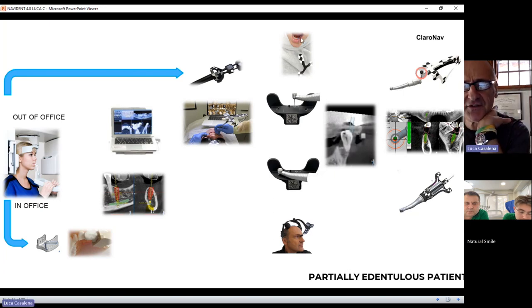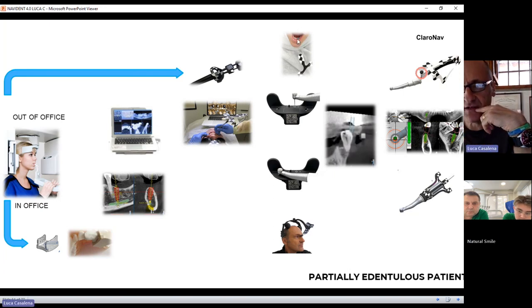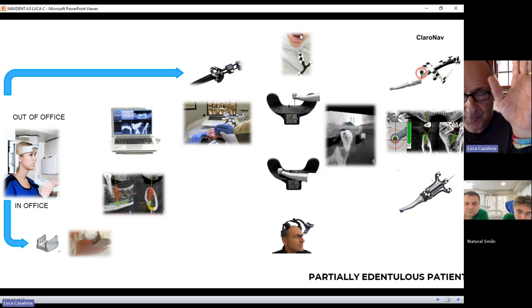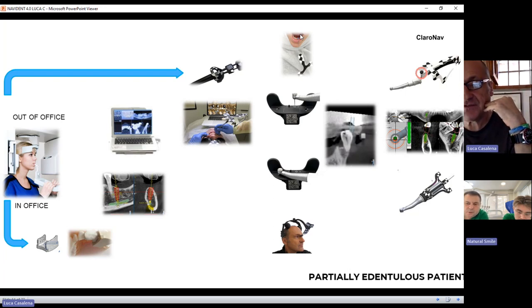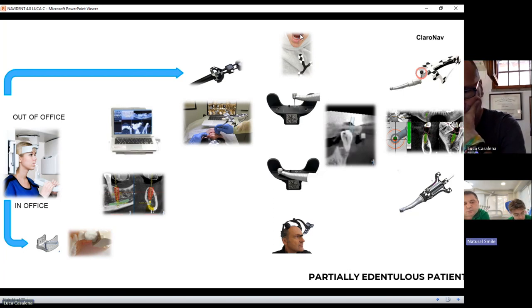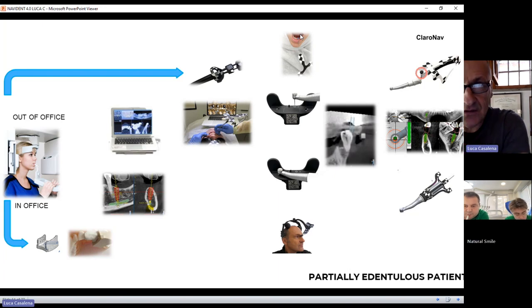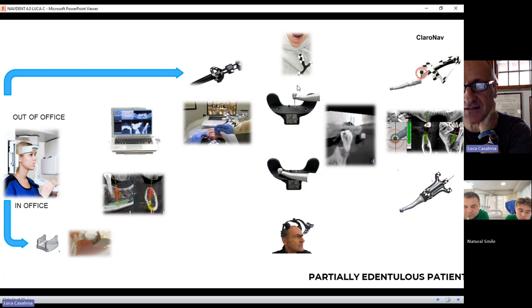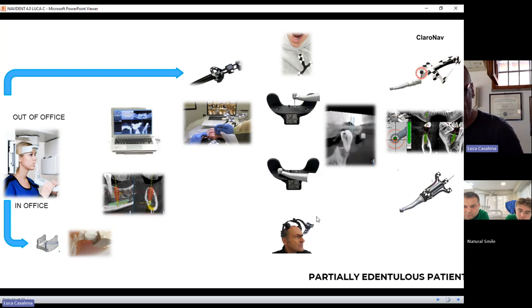If you have to operate in the center — place a canine or an incisor — for the lower jaw, you need to place the target either on the left or the right side. That is also linked to whether you are right-handed or left-handed, because the optical targets need to be read by the Micron Tracker stereophotogrammetry cameras.